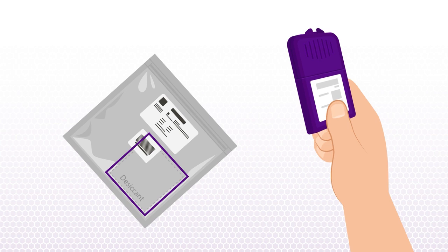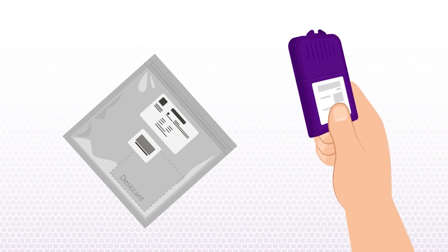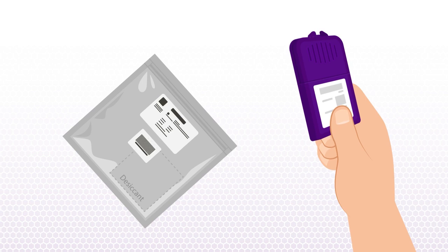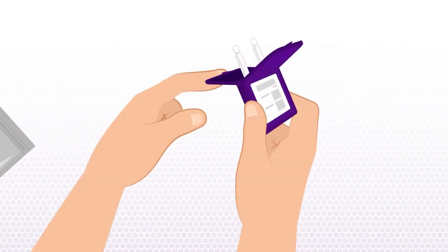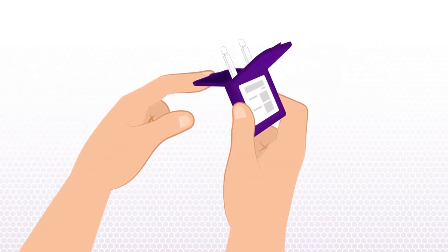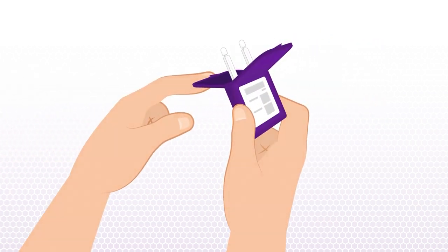When ready, remove the Mitra device from the specimen bag but leave the desiccant inside. It is needed to keep blood samples dry during shipment to the lab. Next, open the Mitra device by pulling apart the tabs at the top to expose the samplers inside.